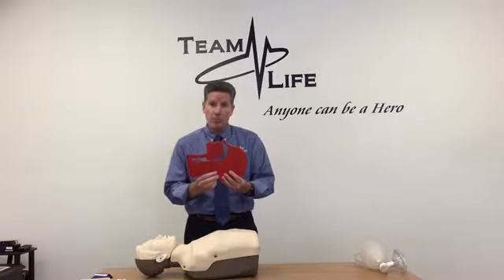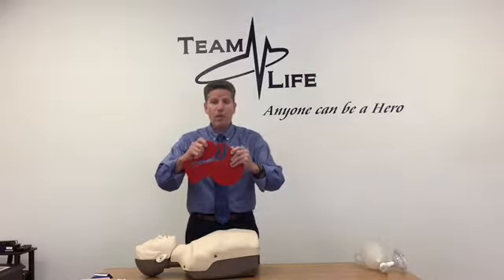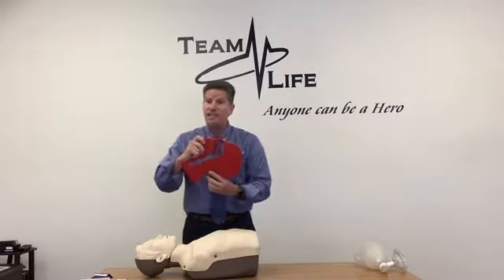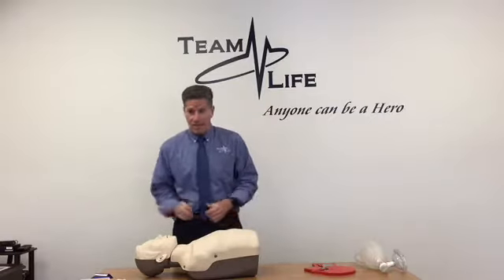So we need to go ahead and move that, and we do that with what we call the head tilt chin lift. A hand on the forehead, a hand on the chin, we tilt back and lift up. As you can see, now both the oral and the nasal airway is open so that medicine can get into the lungs and into the circulatory system. So 911 is called, I have my Narcan.